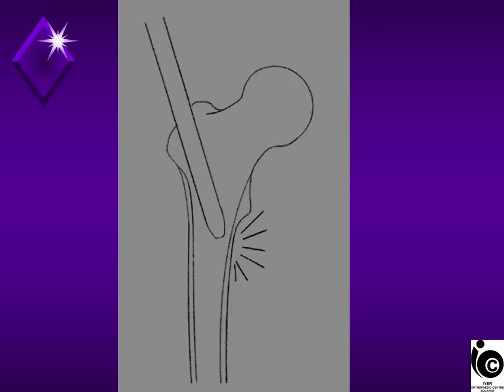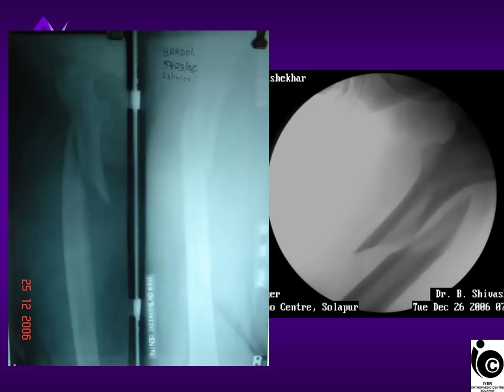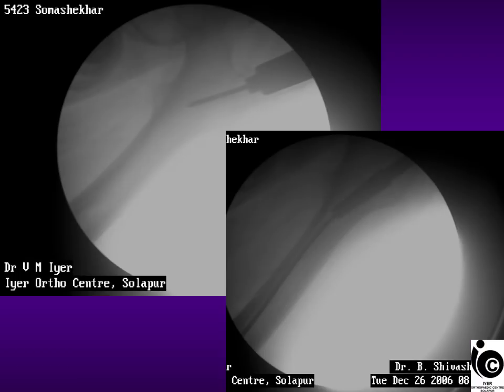If you take the tip of the trochanter entry, the nail will hit medially and you might cause an iatrogenic fracture. A shorter nail you can sometimes negotiate, but a longer nail, as you can see in this case of a subtrochanteric fracture, beautiful reduction, but the tip of the trochanter entry has been taken.